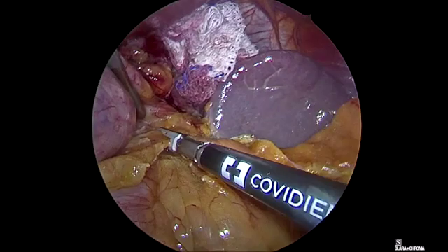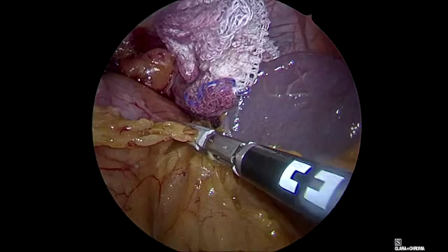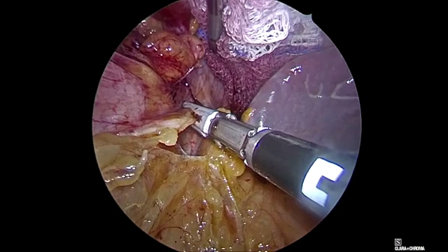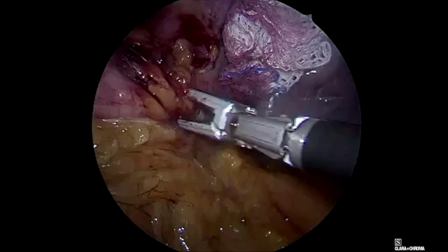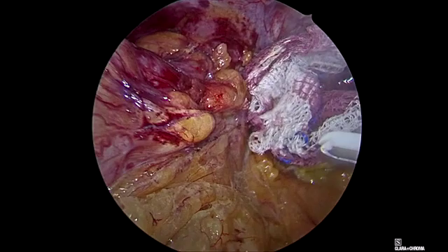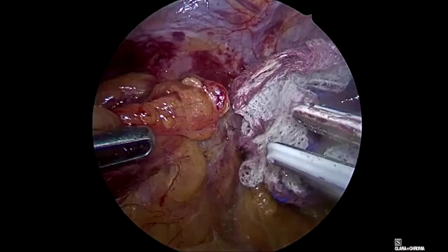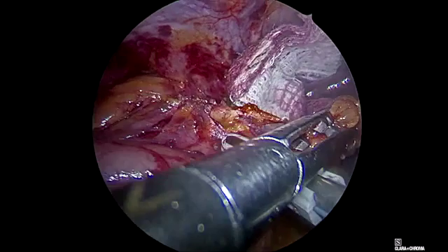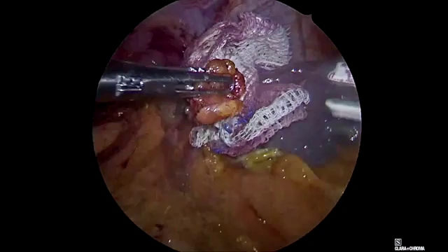We find this window to release completely the gastric fundus until we see the left arm of the crura. It is important to release the peritoneum completely so that the fundus can be pushed to the right side of the patient. We have to interrupt the peritoneum here completely. These fat pads are in our way and it's simpler to remove them so we can see the esophagogastric transition better, which is important because we will build a cardioplicature before stapling.